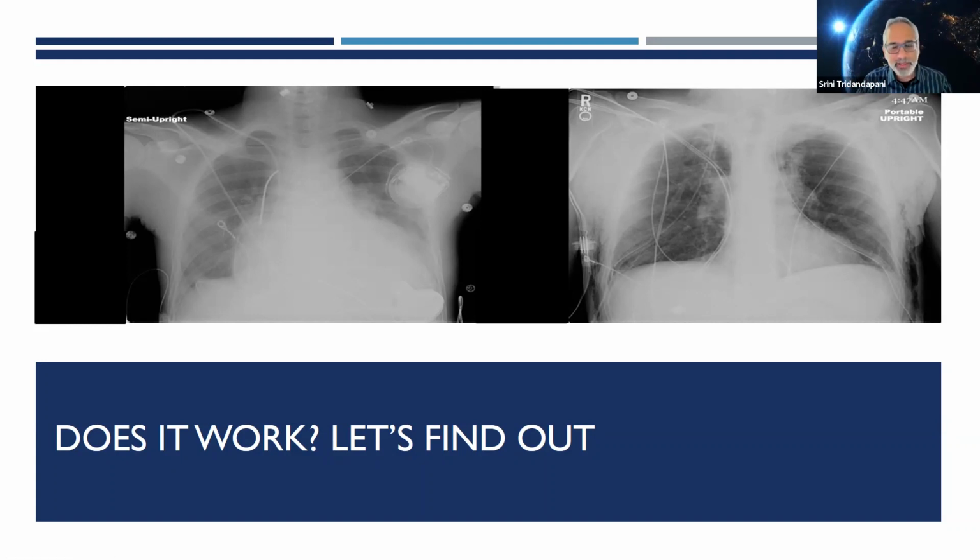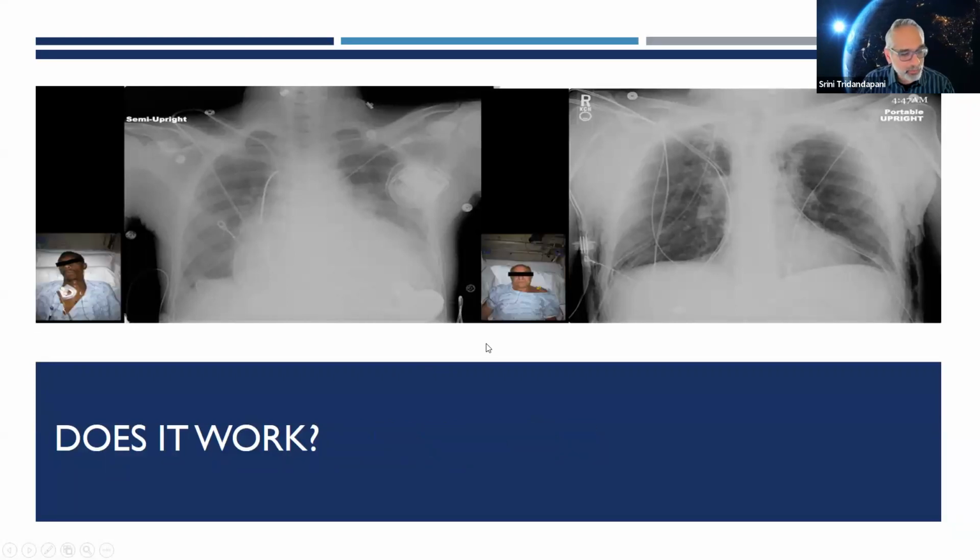And the thing was, there's nothing wrong with that, because this is what radiologists are trained to do. You go from point A to point B, and you come up with an explanation for why this might have happened. But the real reason was that these were 2 different patients. And when we showed it to them with the photographs, nobody missed it. Nobody mistook these mixed-up radiographs, which we simulated.